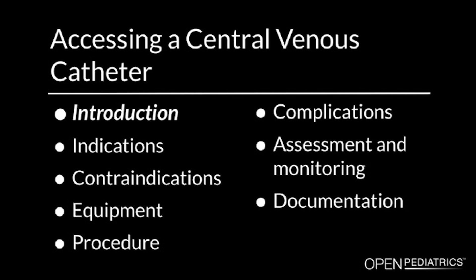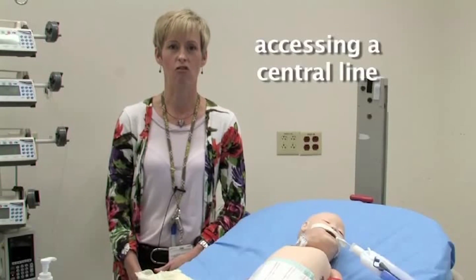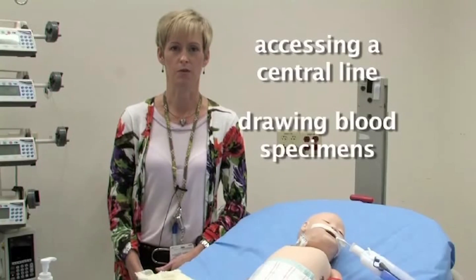Introduction. Hello. My name is Mary Jean Manning. I am a clinical nurse specialist in pediatric critical care for the critical care department at Children's Hospital Boston. In this segment, I will be reviewing access of a central line and drawing blood specimens.